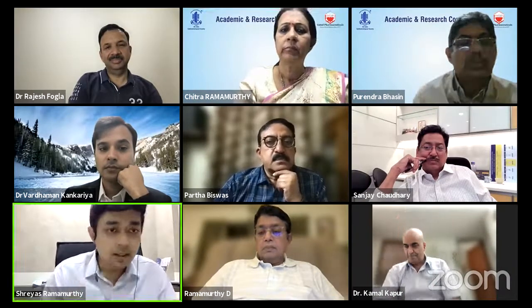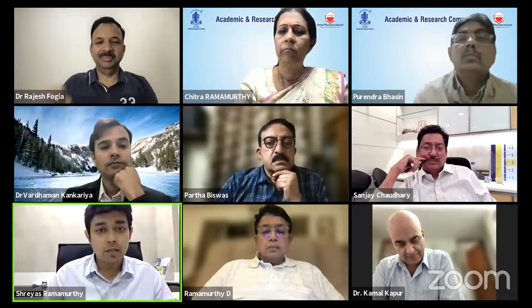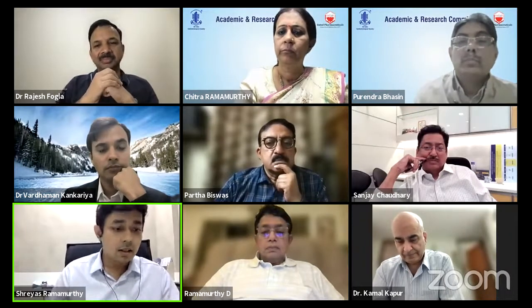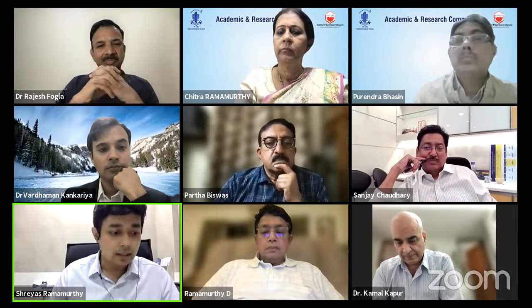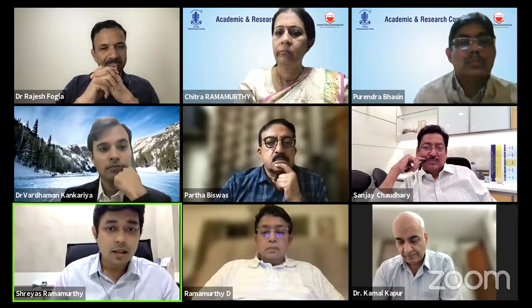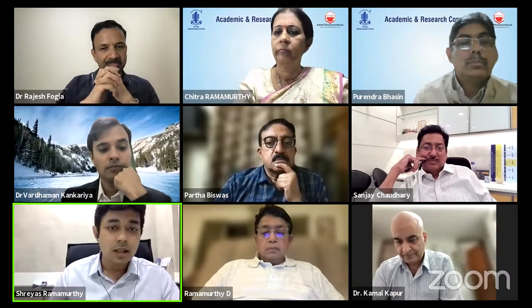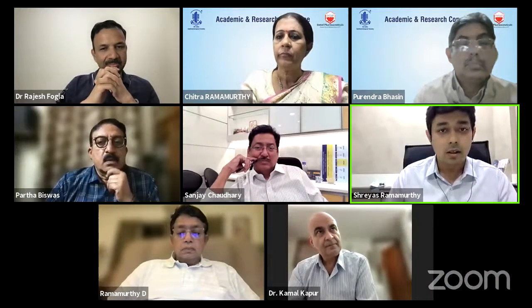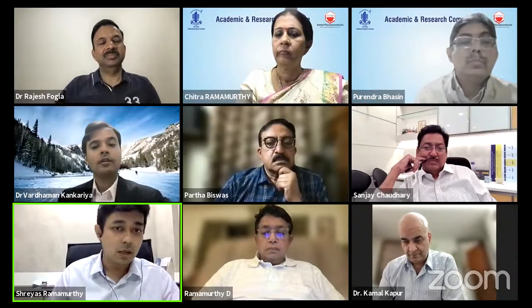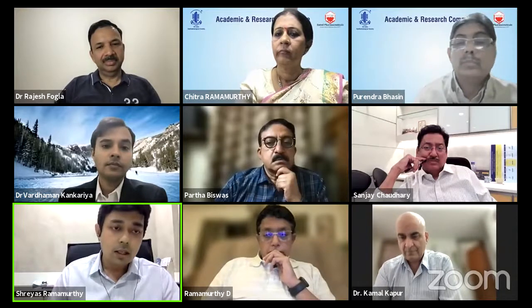No, I mean, that's the basis of the study that we did, and even from experience from a lot of cases. Unlike what Dr. Anaga said, in most multi-surgeon, larger volume practices, it's very, very rare that the operating surgeon actually measures the white to white. It's usually measured by a trained or skilled optometrist. So there are variations, no doubt, and that is why we want to look at alternatives to just the digital caliper measurement alone.